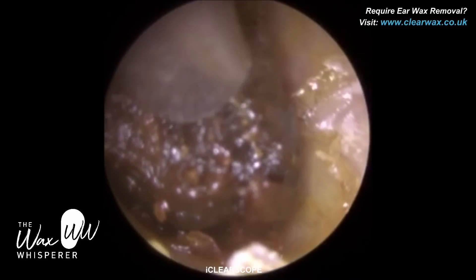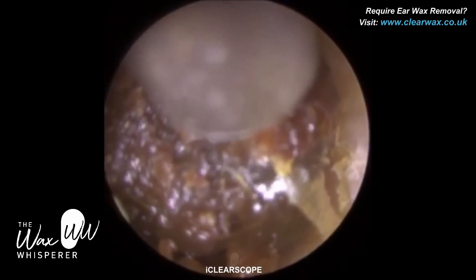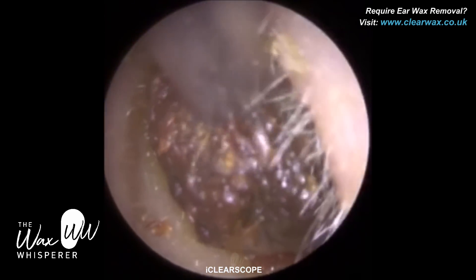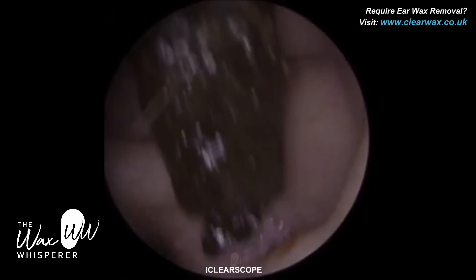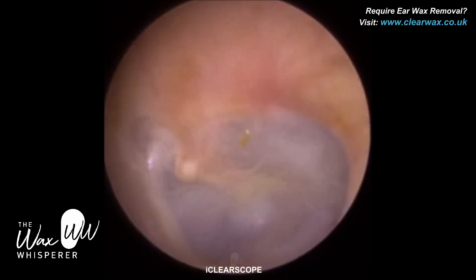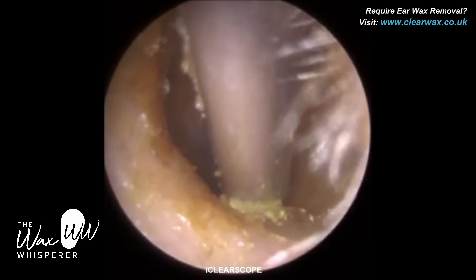Quite often we see other endoscope devices on the market and we look at them critically, because we've done our research. The iClearScope has not been made by accident — it was 18 months of solid research to get where we were, not only in terms of the working length, but the focus, the field of view, and the magnification. These are all individual factors we had to marry together. We also spent a lot of money on certification, getting it authorised, and we've done clinical trials on it as well.